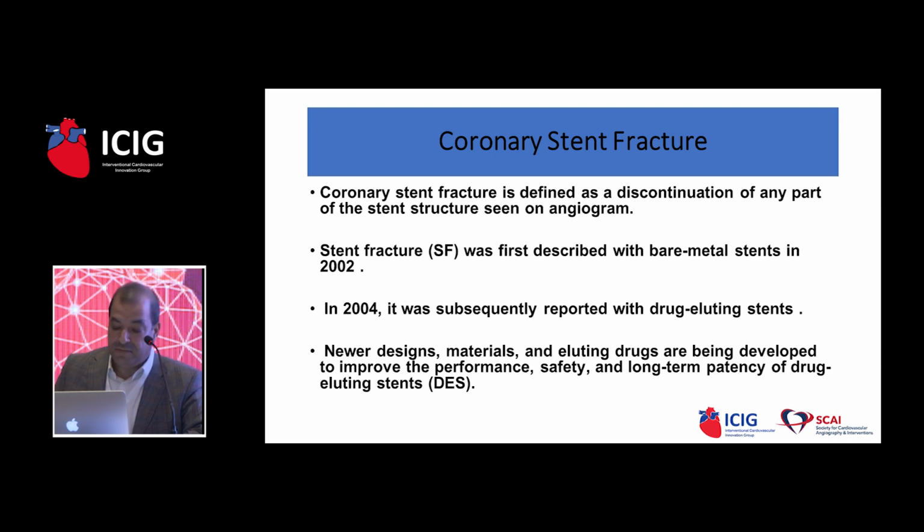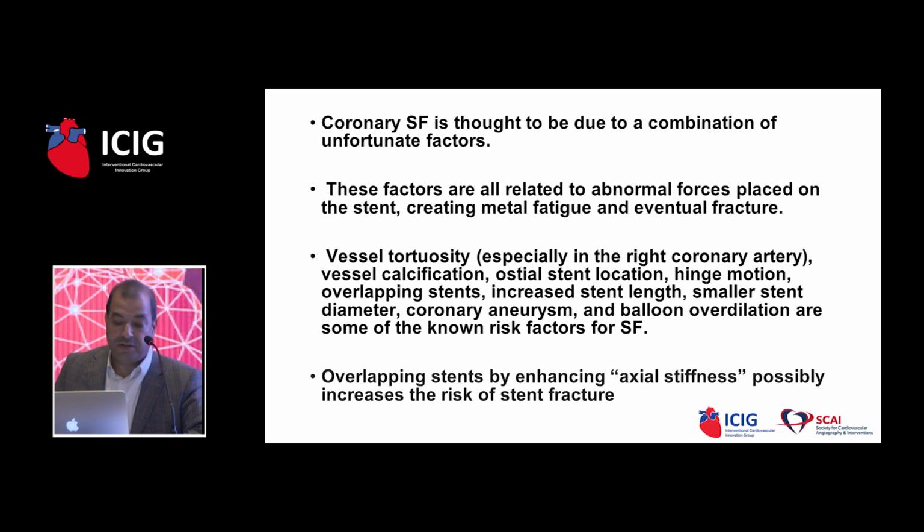The newer designs, materials, and eluting drugs are being developed to improve the performance, safety, and long-term patency of these drug-eluting stents. Coronary stent fracture is thought to be due to a combination of unfortunate factors. These factors are all related to abnormal forces placed on the stent, creating metal fatigue and eventual fracture: vessel tortuosity, as you said, mainly in the right coronary artery, vessel calcification, ostial stent location, hinge motion, overlapping stents.